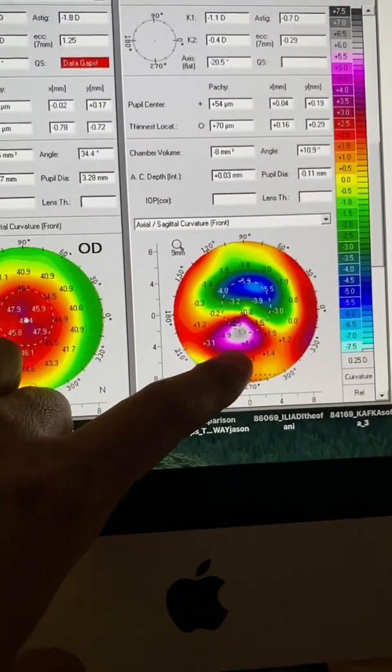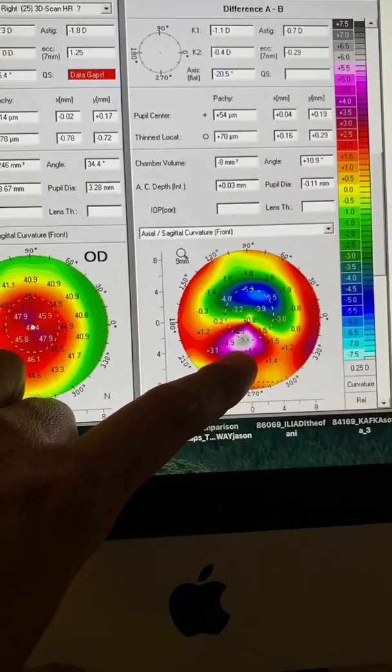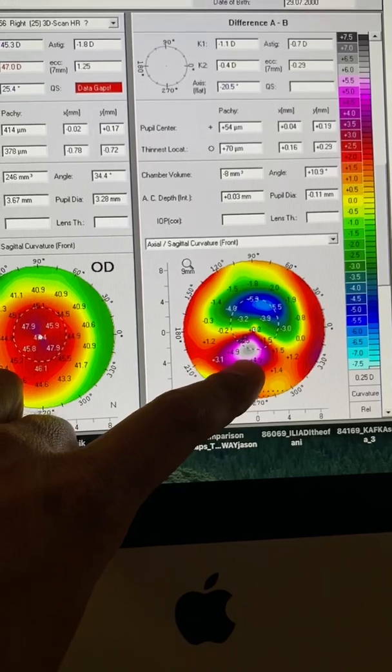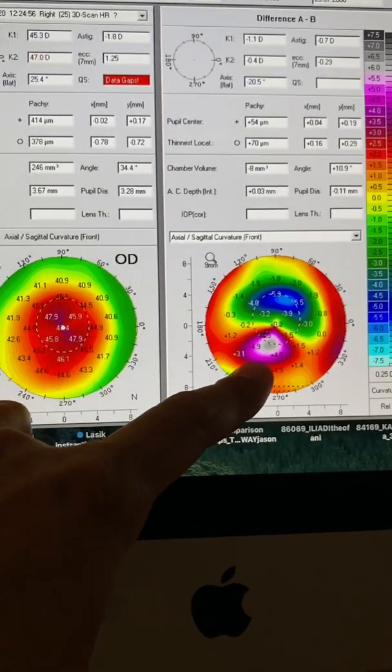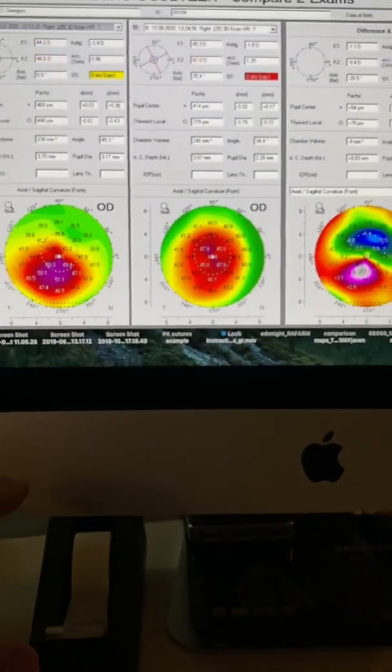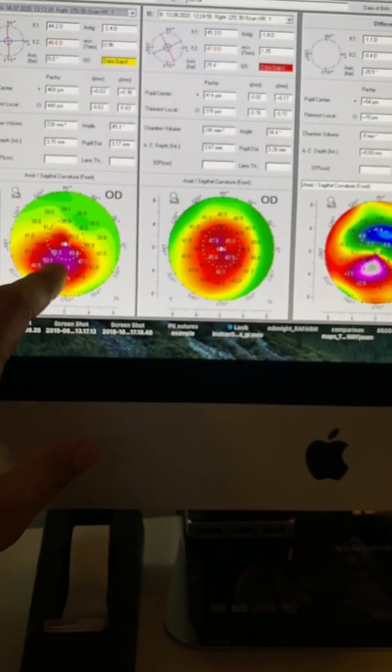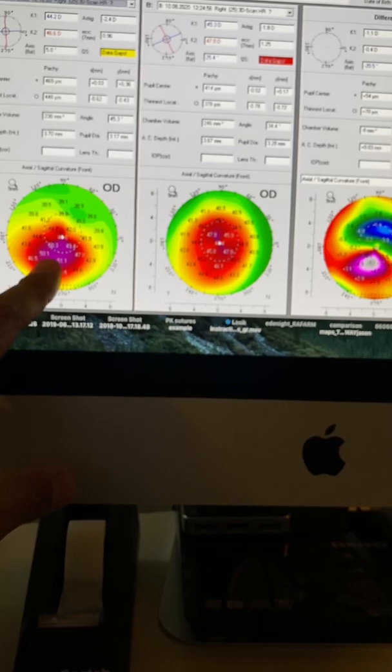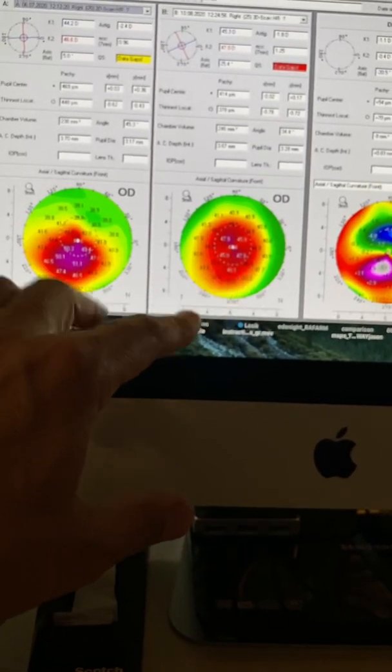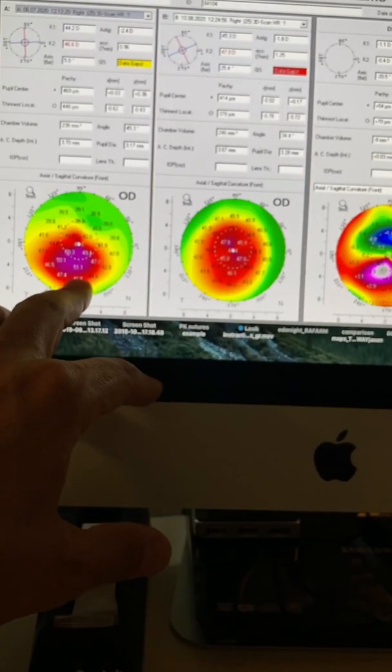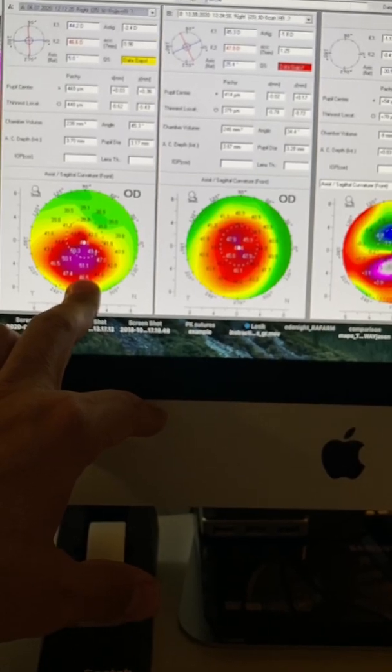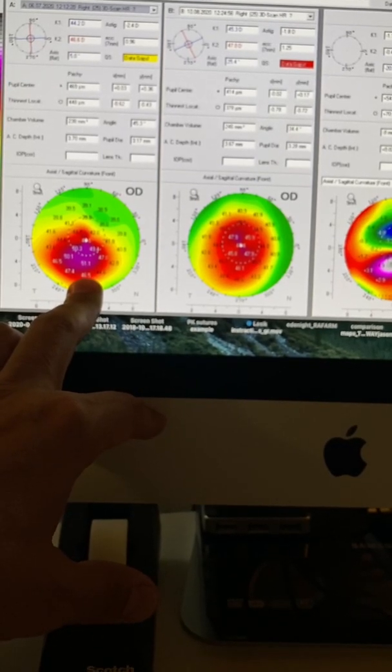And we have a flattening of the cone of about seven diopters here. It's not just the flattening of the cone, it's the fact that this is done right where the cone was. So this shows the second rotation adjustment that the EX500 did in this topography guided normalization.